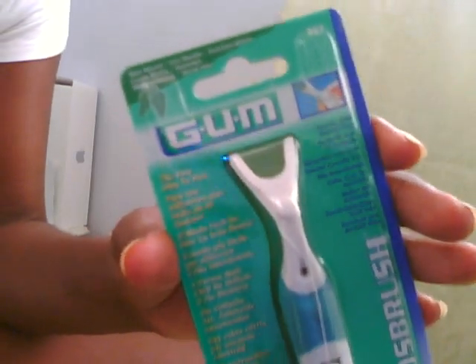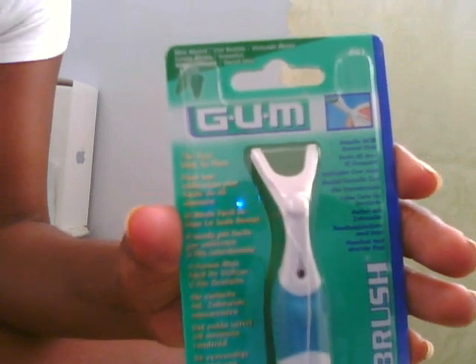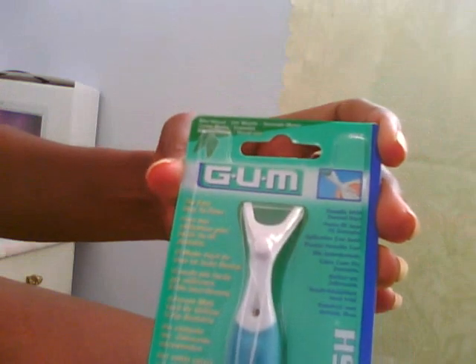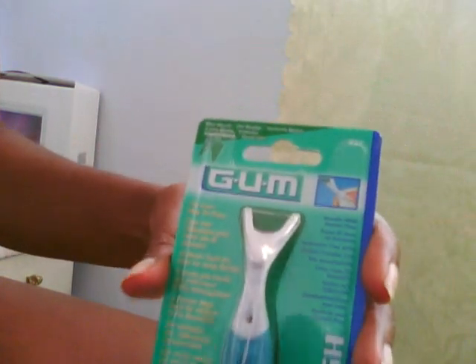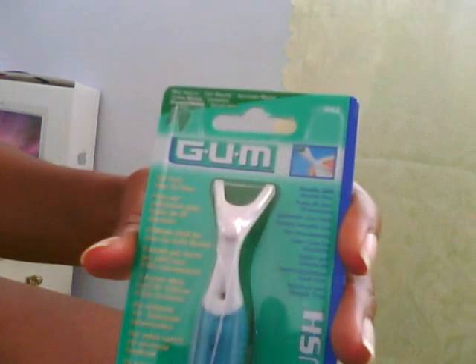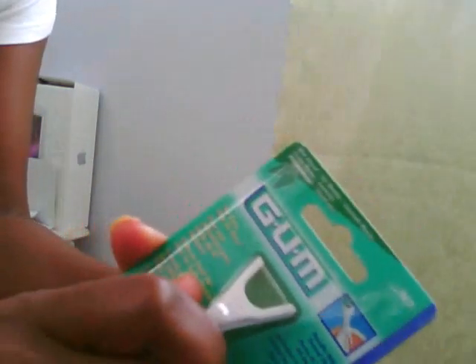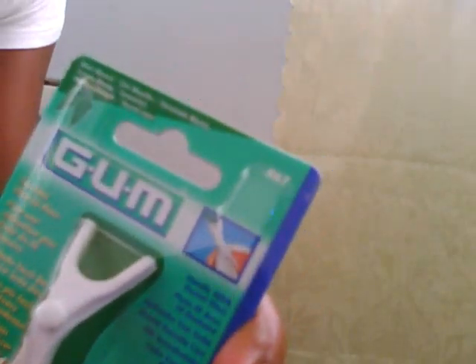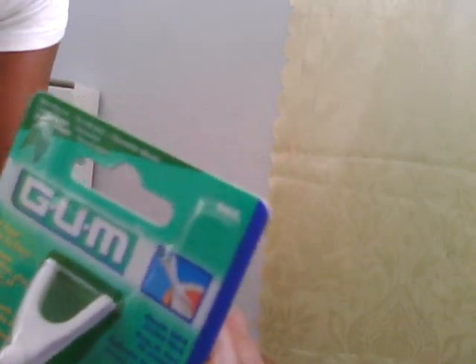Hi, this is a product that I found for people who have problems using the regular dental floss. Now what it is is a floss brush, which is a sort of device with a handle and the floss is actually strung across here. And all you have to do is really hold on to the handle, angle it in whichever direction in your mouth so that you will be able to floss.